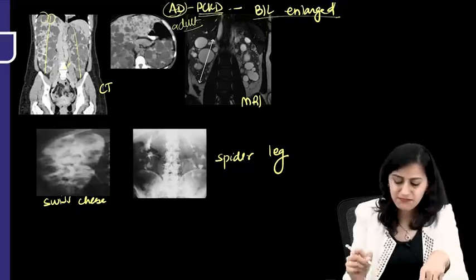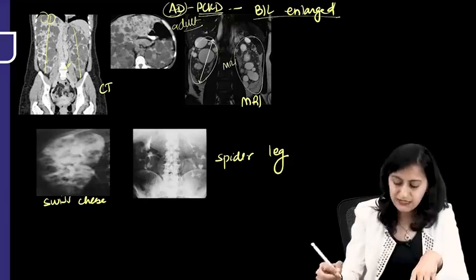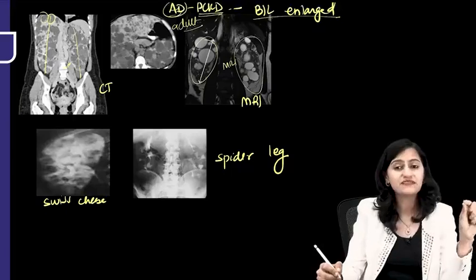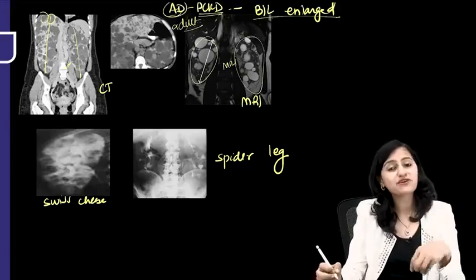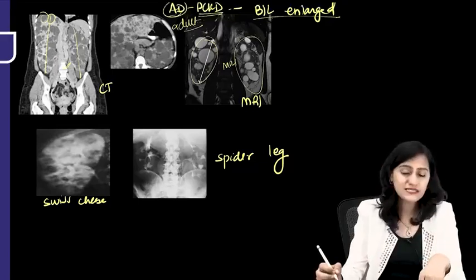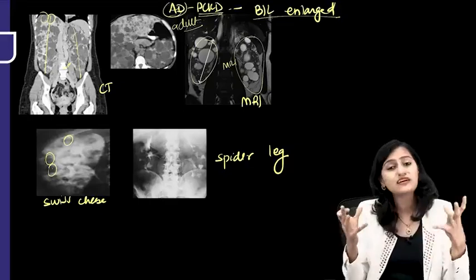This is a CT scan because the bones are white. This is MRI because the bones are black. Previous FMG question, identify this is CT or MR and what is it showing. What do you see in a nephrogram in autosomal dominant polycystic kidney disease? The cyst will not take up the contrast.